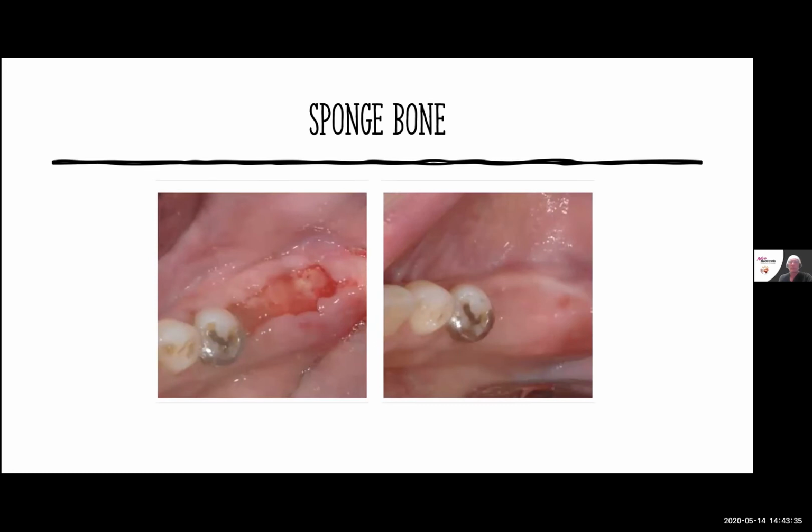I find that with the sponge bone, I have less loss of bone when I have an exposed membrane than when I have a particulate bone that I've placed and an exposed membrane itself. With this one, you can see that at the removal of the membrane and then the regrowth and recheck of this back, we even left that open, and that continued to granulate in to the point that we now have keratinized tissue that's over the entire ridge itself.